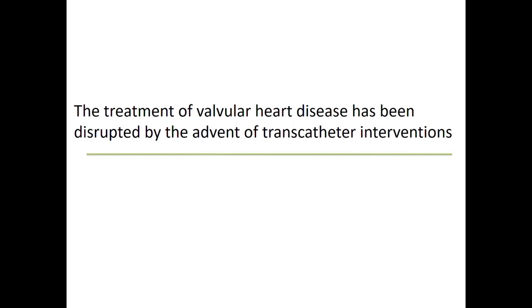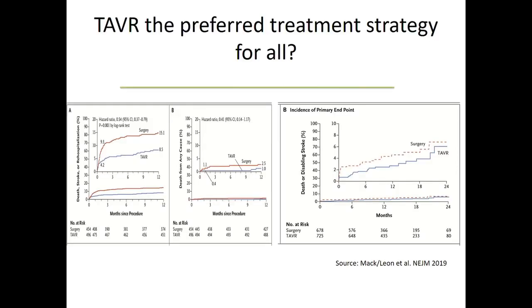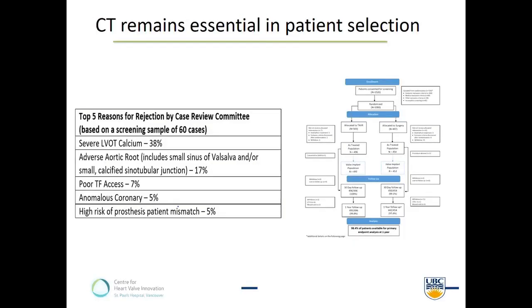So I think what we heard, and this is clearly redundant and expressed so eloquently by Ron, is that the treatment of valvular disease has been disrupted by the advent of transcatheter interventions. We saw these data just now, very much supported by all those innovations and advancements. We saw that not only was there equipoise between TAVR and SAVR, but actually there was superiority when it came to a combined endpoint in one trial, and equipoise when it came to the major complications in the other trial. So no doubt that TAVR is here to stay.